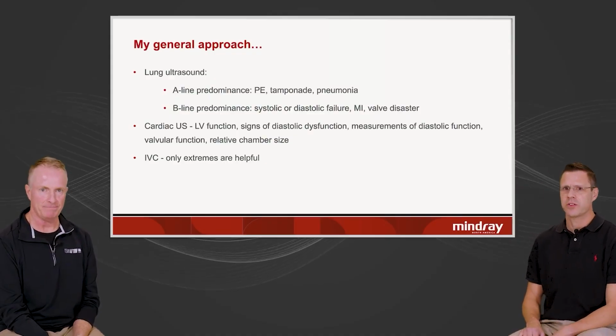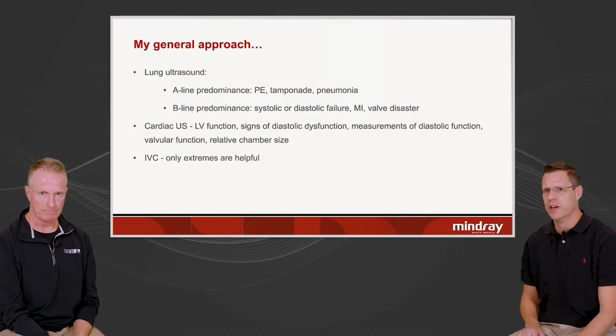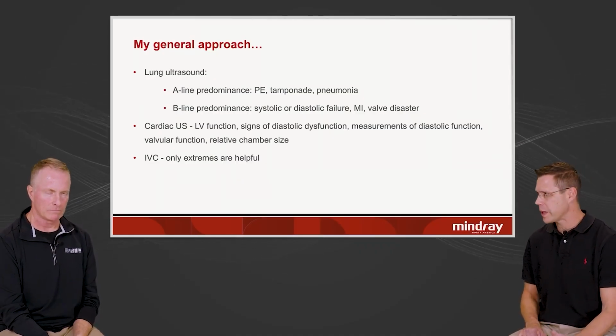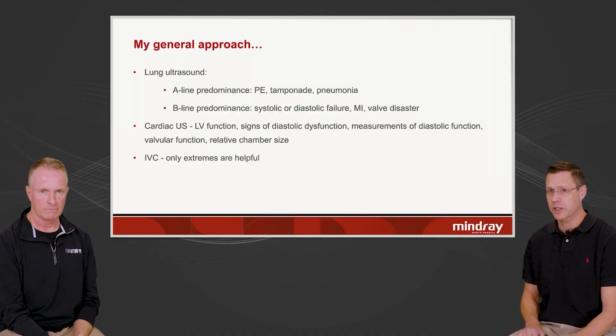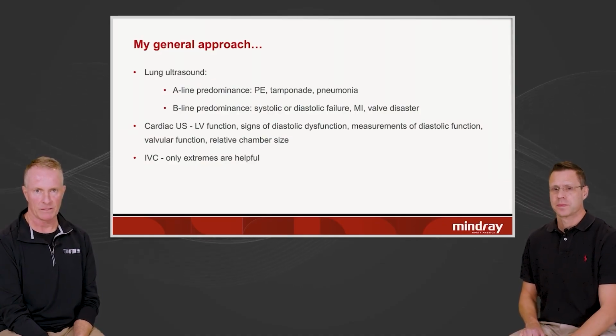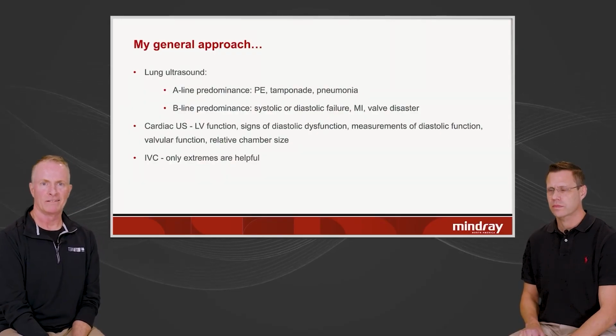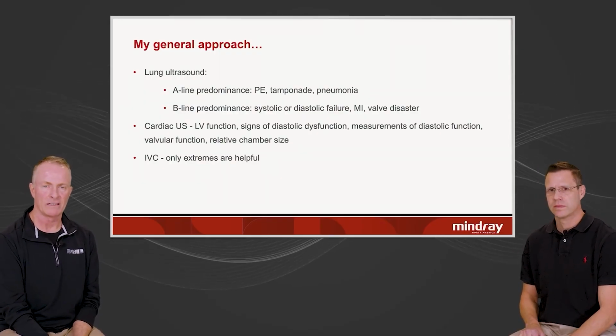And I think labs can send you down the wrong road too. The hyperdynamic left ventricle causes the BNP to be elevated. And in that person, if you relied solely on the BNP, you may not fluid resuscitate them when that's actually what they need. So you really need to pay attention to lungs, ultrasound of the lungs, heart, and IVC will lead you in the right direction.